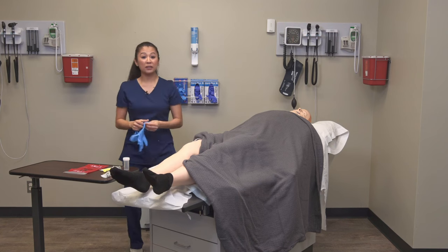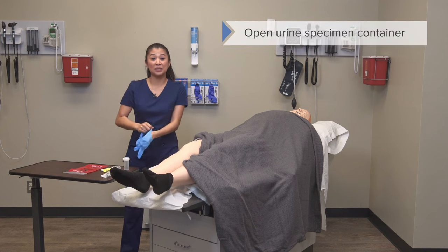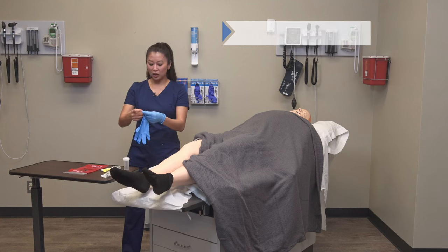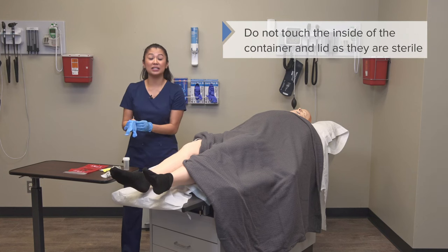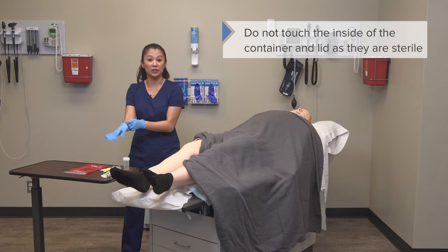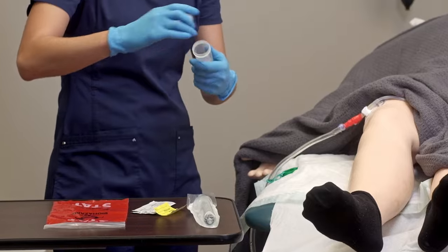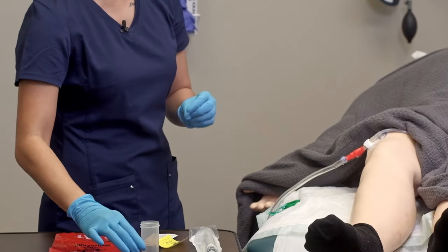Now that I've done that, I also have my sterile specimen container here. I want to go ahead and open this up. Just know that anything inside this container is sterile, so you don't want to touch the inside surface.